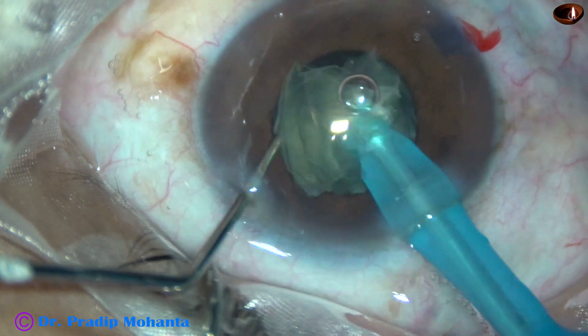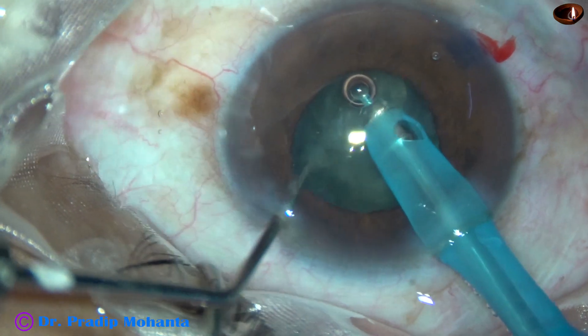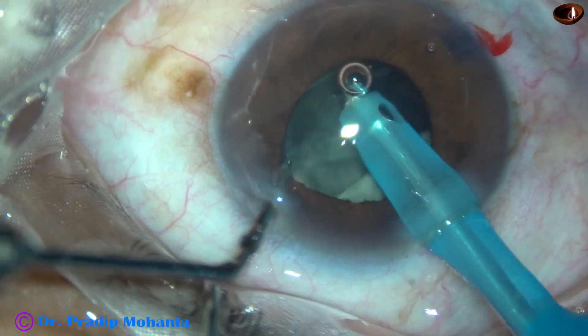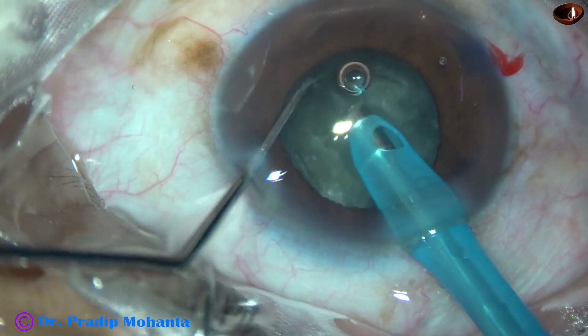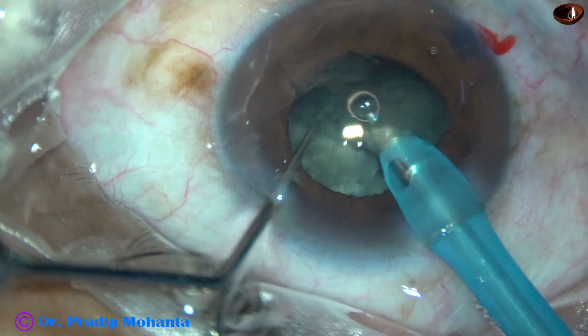Since the cataract is soft and since I am able to hold and chop the nucleus, the case can be managed without using any pupil expansion device.